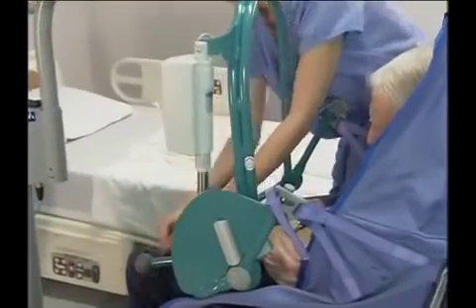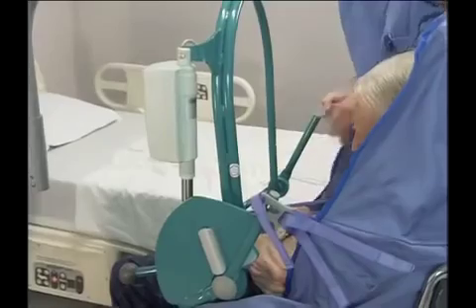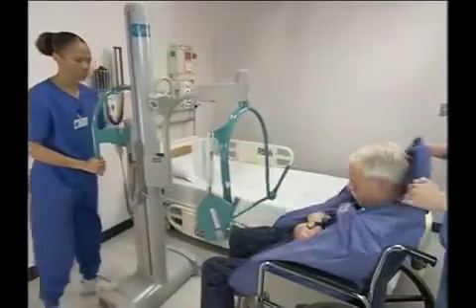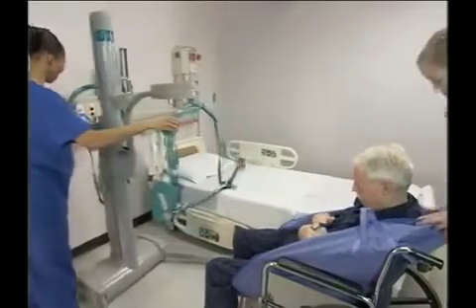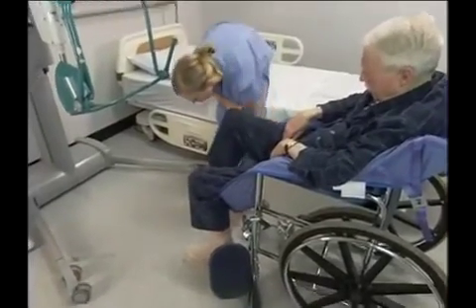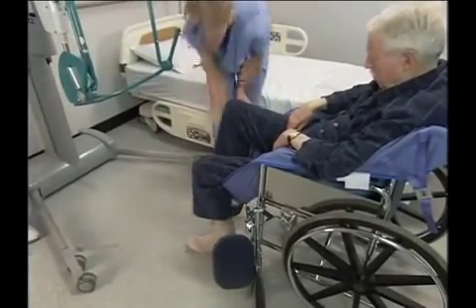Release the sling from the swivel bar. Then move the lift out of the way. Leave the sling under the person so it's ready for his return to the bed. Reposition the wheelchair's footrests and armrests and put the person's feet on the footrests.